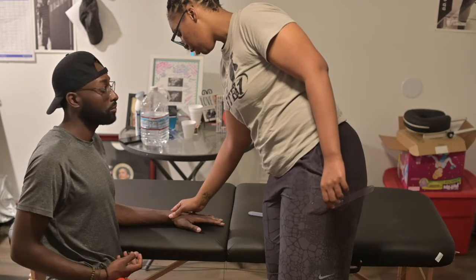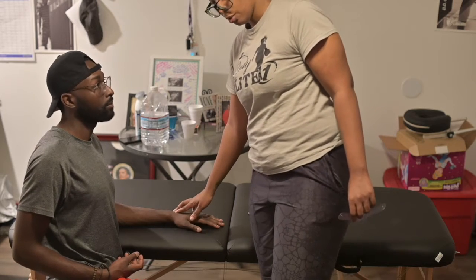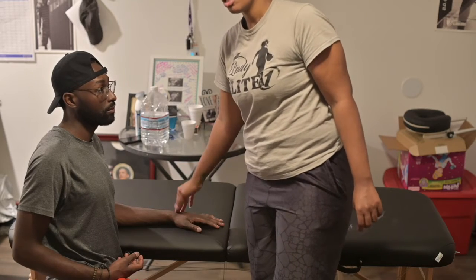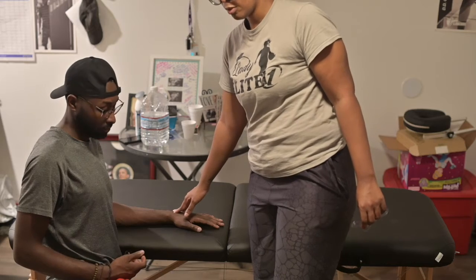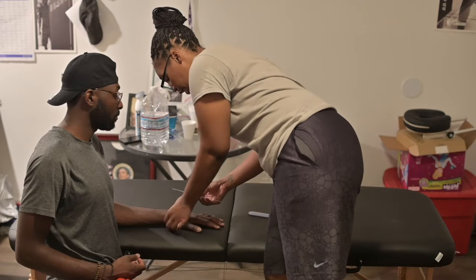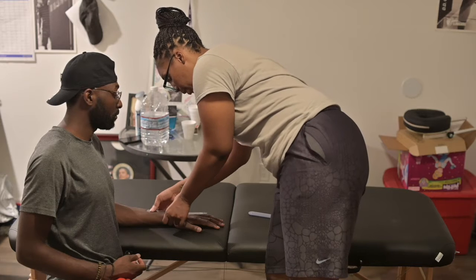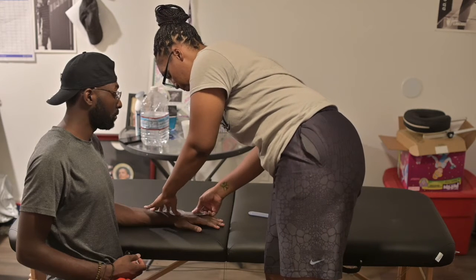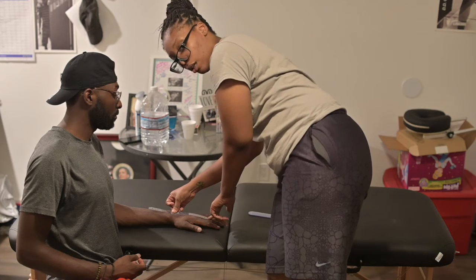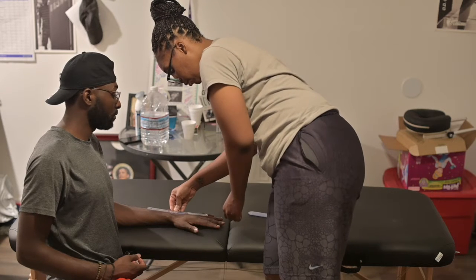So we want to palpate. Here's our ulnar styloid process. So it'll be in the center of the carpal bones, which means in the center, superior or proximal to the wrist joint, center of the carpal bones. That's where the capitate is located. So again, you want to palpate, make sure you have the right region. Our stationary arm again bisects the 2 bones of the arm, and the mobile arm is along the third metacarpal. So go ahead and perform your radial deviation.